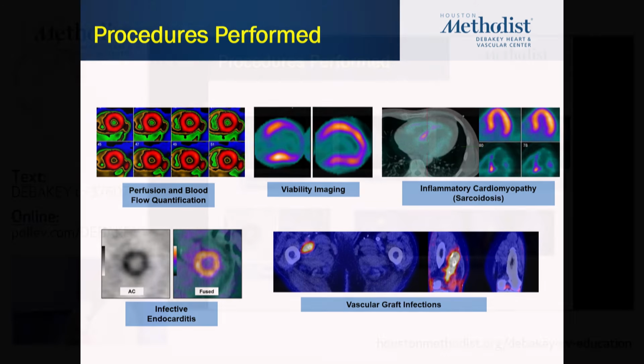How useful is it in LVAD patients with the device and then the drive line coming out? So yeah, I didn't put it here, but there have been multiple studies that have shown that it's very accurate and does predict the site of infection in these patients. So whether it's in the hardware itself or in the drive line, and obviously if it is in the central unit, central infection, it's kind of the worst outcome for these patients.